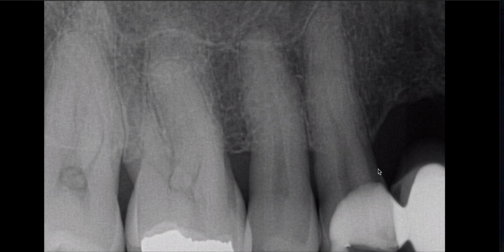And the second is you can see that it's a little bit rotated, because there's potentially the invagination of the mesial part of the root, or it's another root PDL entirely. It's hard to tell unless we had a 3D image. But one of the things you've got to look for is this: you see how the pulp chamber goes towards the distal?